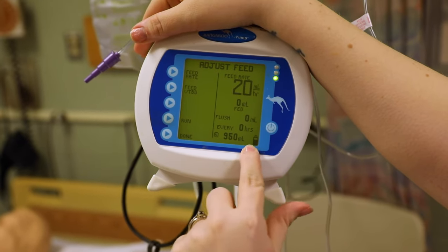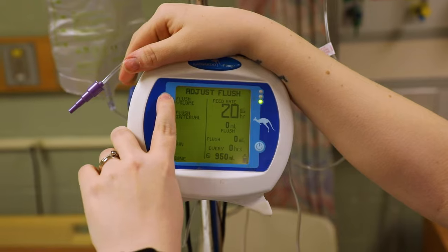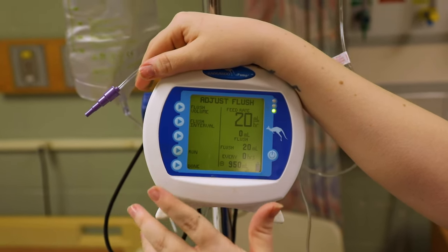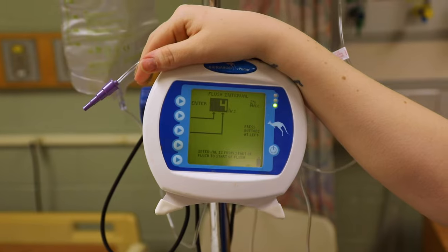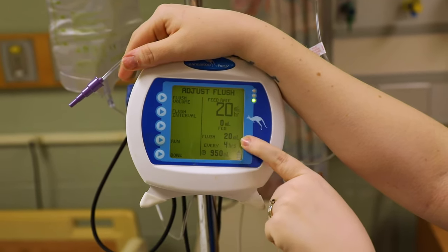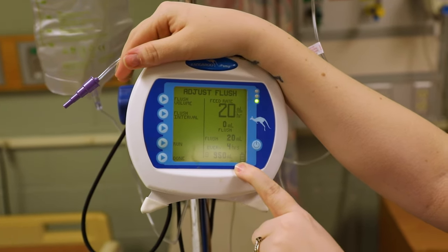You have the option to adjust a flush as well — definitely check your orders and make sure the patient is not on a fluid restriction. For flush volume, the doctor wants 20 ml's, entered every four hours. So what this is now telling me is: feed rate is 20 ml's an hour, it will flush 20 ml's of fluid every four hours, and 950 ml's of feed will go in.